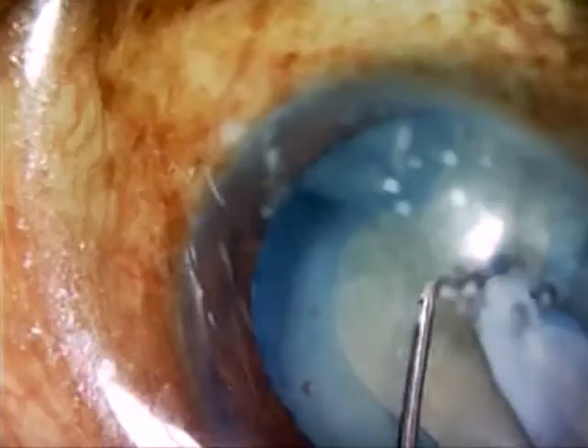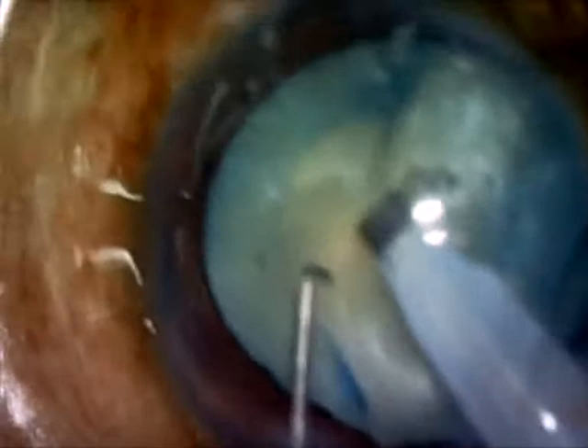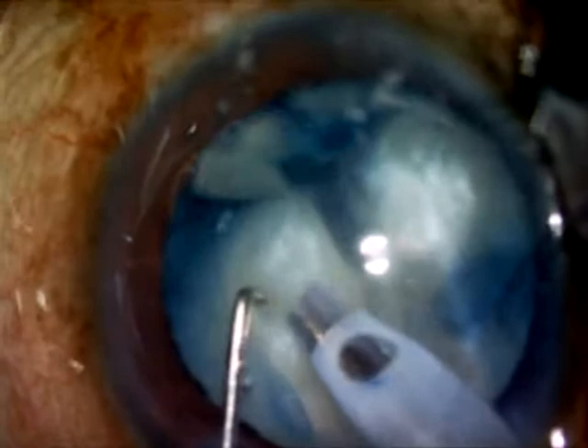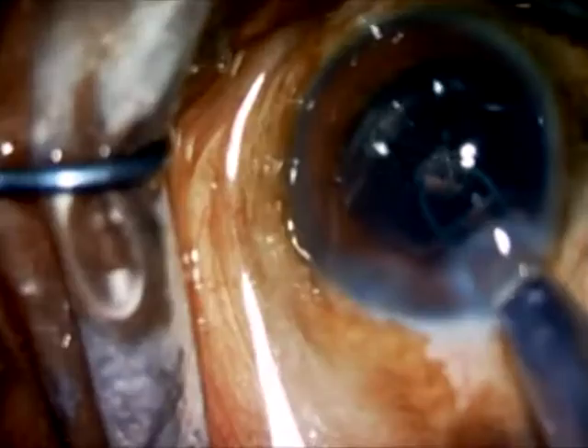The cataract is emulsified in the iris plane, or to a certain extent in the anterior chamber, with the endothelium being protected with a good viscoelastic like Viscoat, which is used at regular intervals to inflate the anterior chamber. In this particular case, the Argentina flag sign is converted into a semicircular rhexis on either side, with a successful implantation of an intraocular lens into the bag. The patient did very well postoperatively with a vision of 6/6 N6.